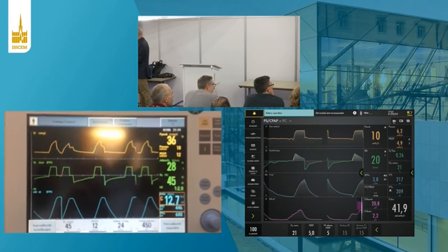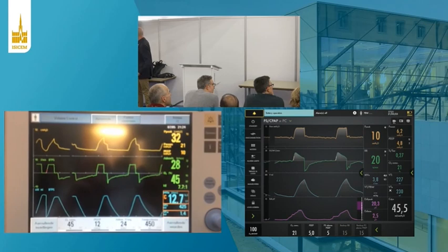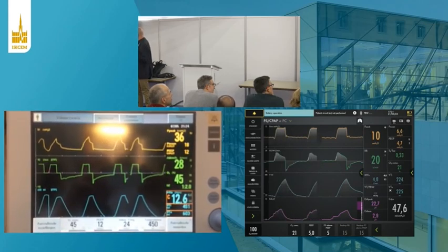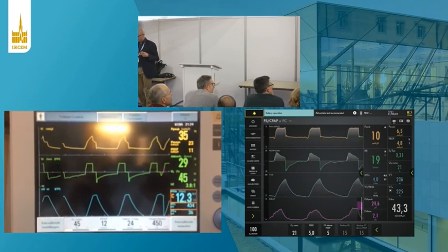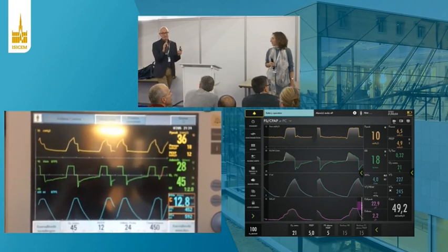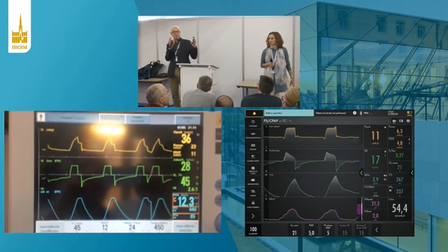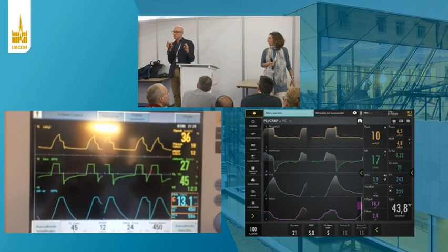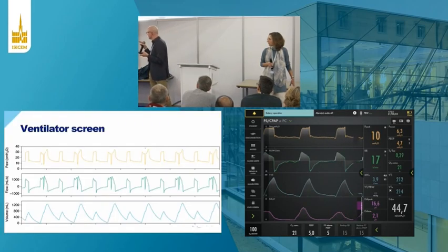Okay. So what you'll see right here, this is a mandatory breath, another breath, mandatory breath. There it is. So this is very important. With reverse triggering, there should be a pattern. So you can never say it on one screen, and it could be 1-1, it could be 1 and 2. In this case, it's 1 and 3. But it's very important for a diagnosis of reverse triggering that there is a pattern.